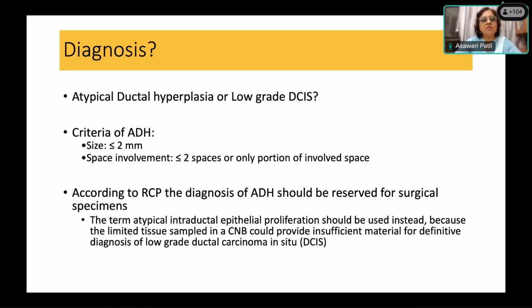Anything else you want to add? We do have another very rare variant, tall cell carcinoma with reverse polarity in the breast, which can look like PTC also. But again, that is an extremely rare variant, and it is very unusual to have nuclear features of PTC in the breast. Preeti Chauhan is asking about tall cell, though, which Dr. Aisha has already covered.